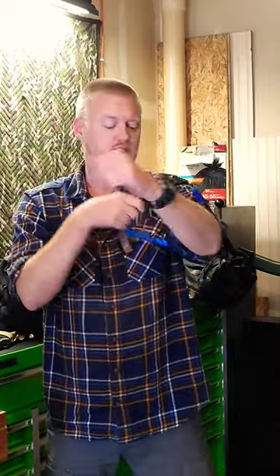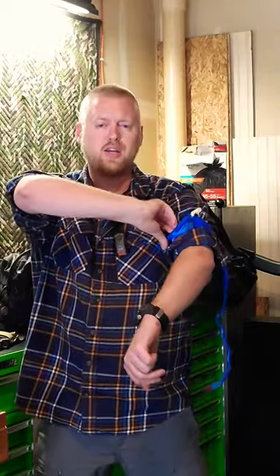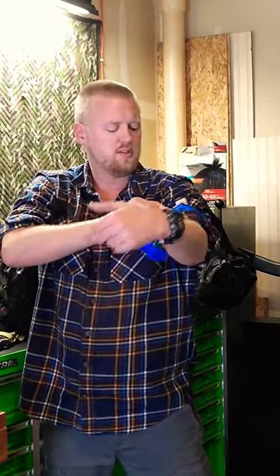Say it's a left arm. Obviously this is handy to be able to do with one hand. You rip up that tab, pull straight up, and then straight down cinching it down as you go. You crank that windlass till the leaking stops. Secure it in these little plastic hooks over with the tail and give it a little pinch so it fits over the windlass in those hooks.